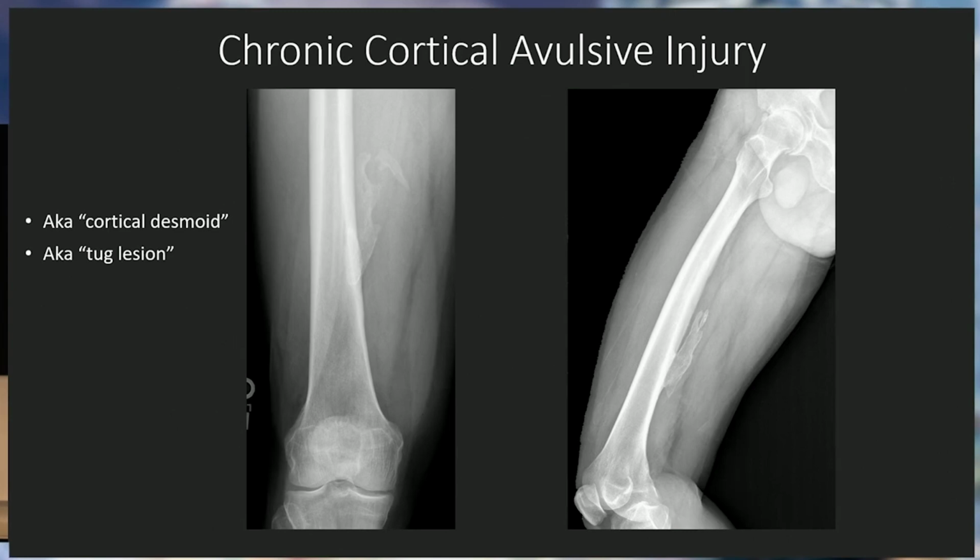So again, it's really important with an image to put the findings in context to match the patient. And for these skeletally mature patients that have normal variants that look like pathology, if it doesn't fit, a variant is a pretty good explanation.